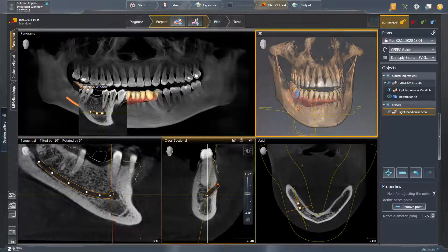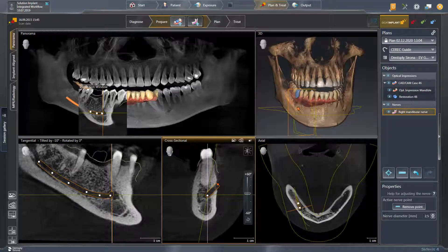In the 3D view, the final nerve path can be viewed. The marked nerve serves only for visualization purposes and is displayed in all views for planning support.